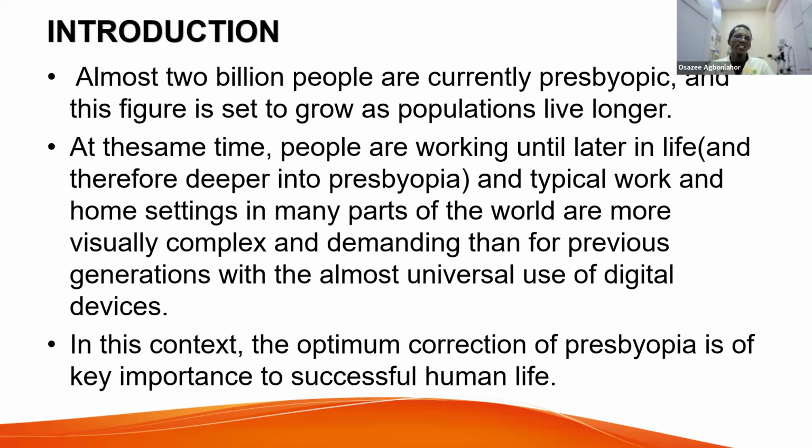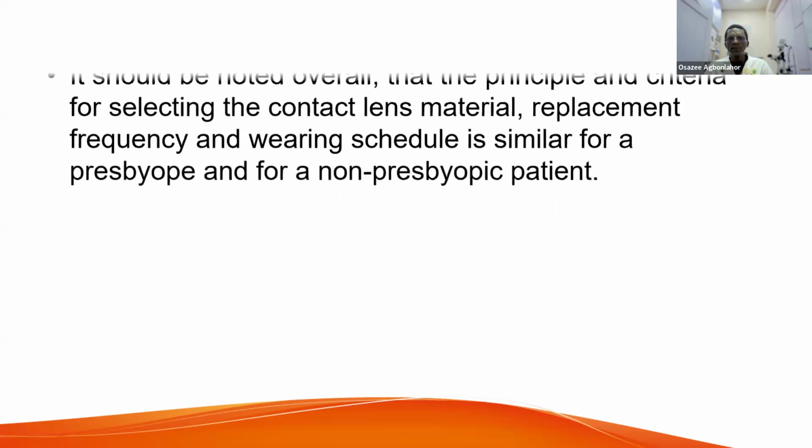So correcting presbyopia in a way that will not make these patients or clients feel as if they are old should be our concern. And trust me, multifocal contact lens is one of the ways out. There may be other ways out, but this is one of them. It should be noted overall that the principle and criteria for selecting contact lens material, replacement frequency, and wearing schedule is similar for both presbyopes and non-presbyopes.